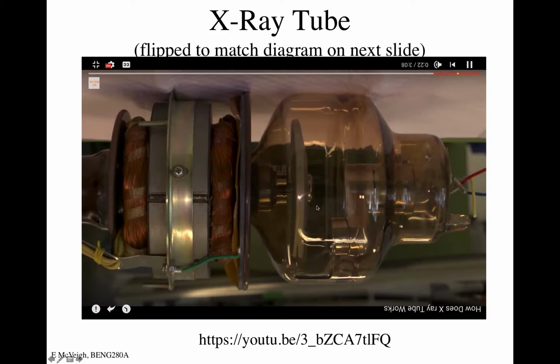And the reason you spin the disc is because, it's hard to see through here, but there's a cathode here. It's a filament coil that is heated up to a very high temperature, and X-rays come firing off this thing. Let me do laser. Come firing off this and hit the anode. Okay? And, sorry, not X-rays. Correct that. Electrons boil off this, are accelerated across here by a voltage and hit the anode.